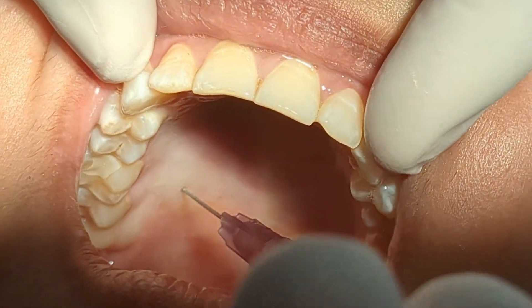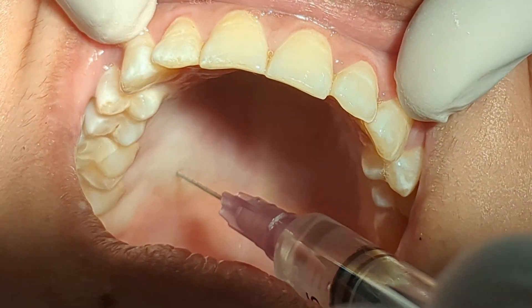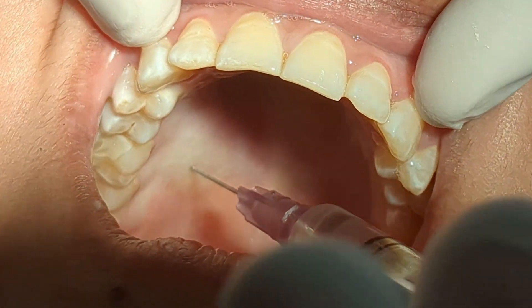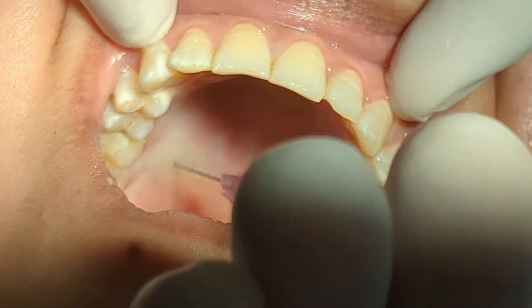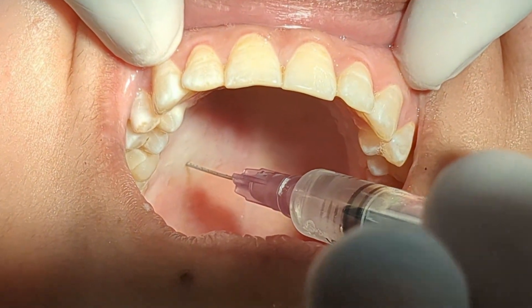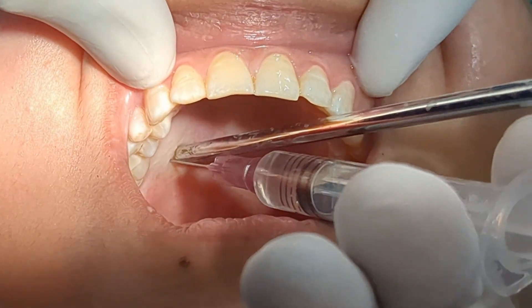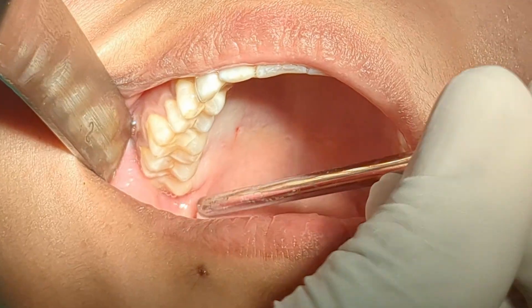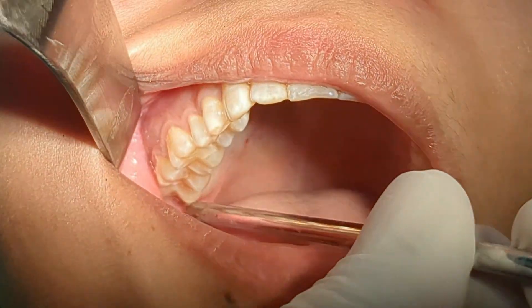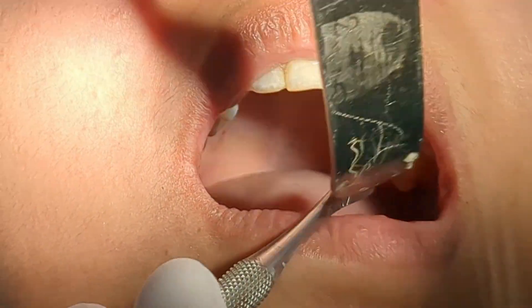You can now see slight bulging and blanching of the tissue at the site of injection. When I withdraw the needle, I ask my assistant to keep the suction at the injection site, especially in case of greater palatine nerve block. This is to make sure that no LA solution drops flow to the patient's throat. The taste of LA solution is very bitter and may induce gag reflex, which we don't want.